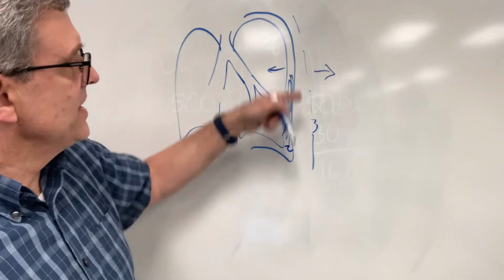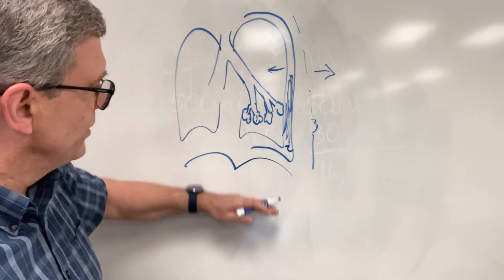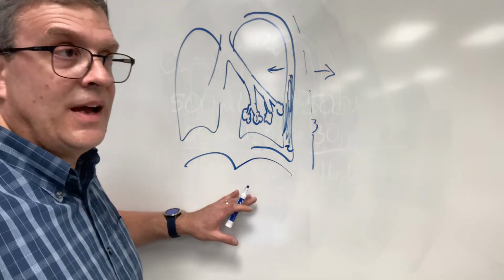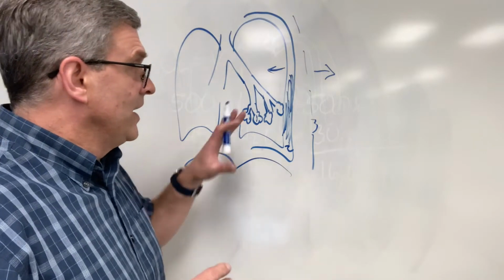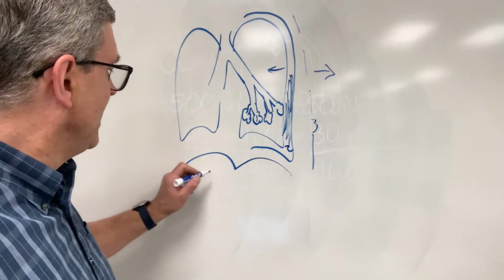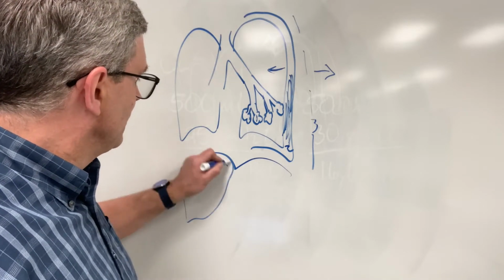Now, we talked about the chest wall, but you also have to remember that the diaphragm is here and it's got to push down. So anything down here in this area below the diaphragm that's in the way of diaphragm movement, the ventilator is going to have to use pressure to open that lung to push against that. That can be things like ascites, and a large liver.